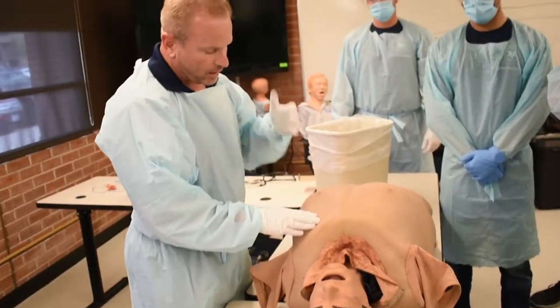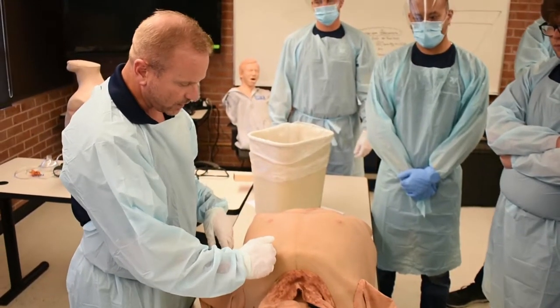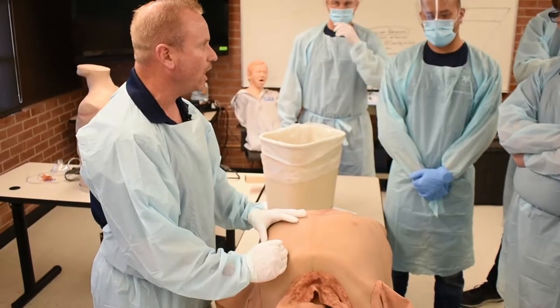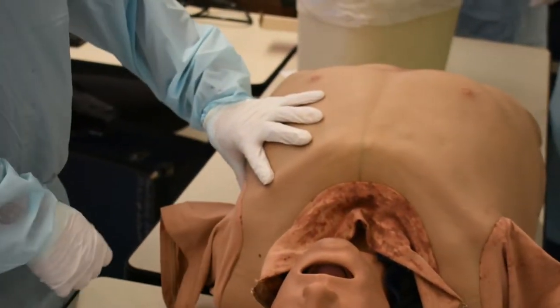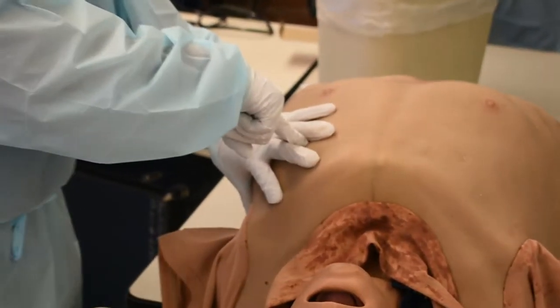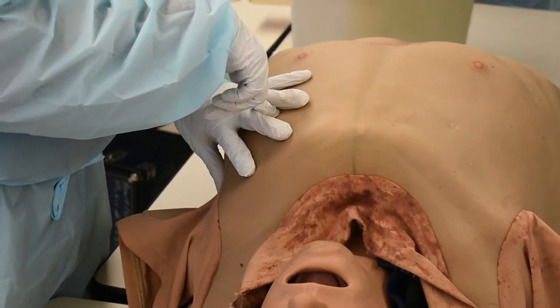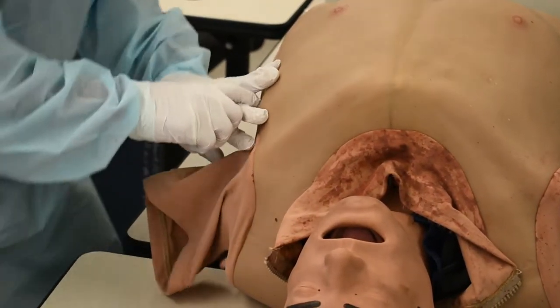Finding landmarks. A lot of people still have to do mid-clavicular, second to third intercostal space. There are a couple ways to find this spot. You can put your gloved finger in the patient's armpit with your hand open and go right between your third and fourth finger. That would work on a lot of people, but our society is getting much larger — that may not be an option if your hand is way back here.